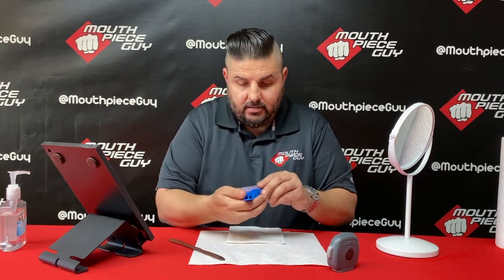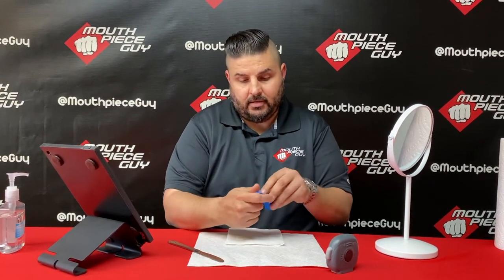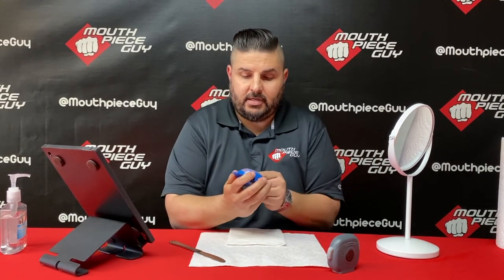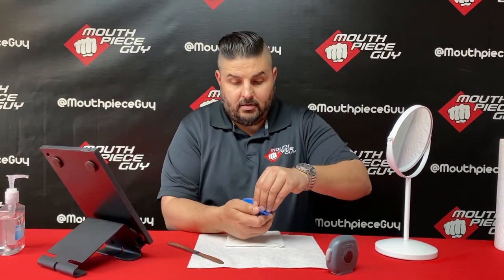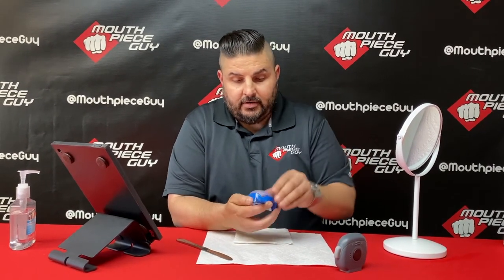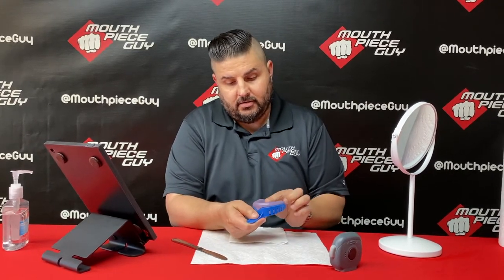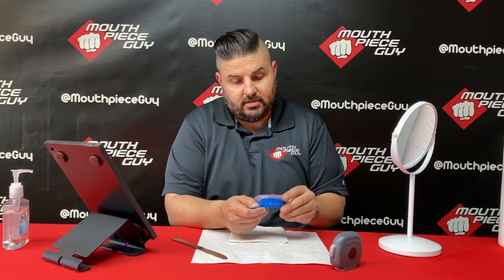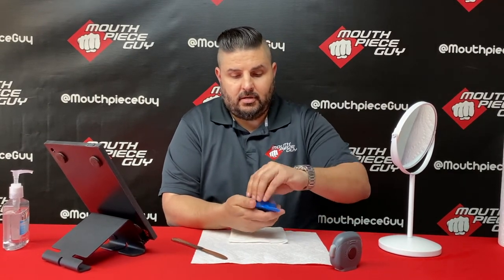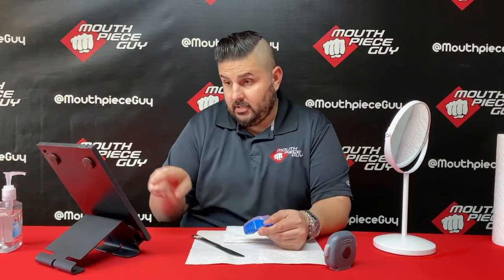I'm going to lay this in the tray, clean it up, and make sure everything looks nice and even. Now we're going to build up that putty in the anterior area, and a little bit on the molars — scoot some of this stuff outward to the gums. Now I'm going to make a little notch, a quarter inch behind the tray. I should be at 130 seconds putting this in the mouth.